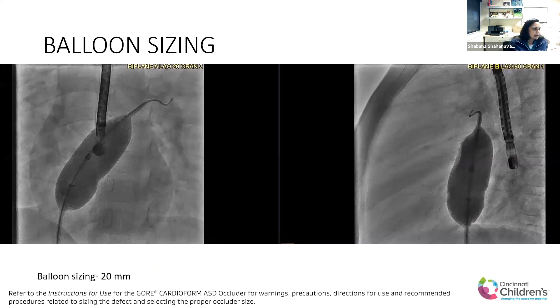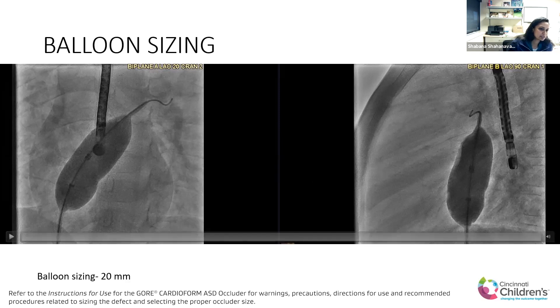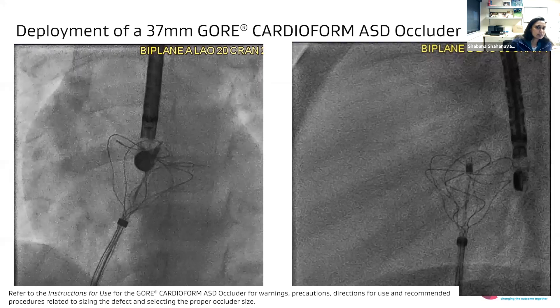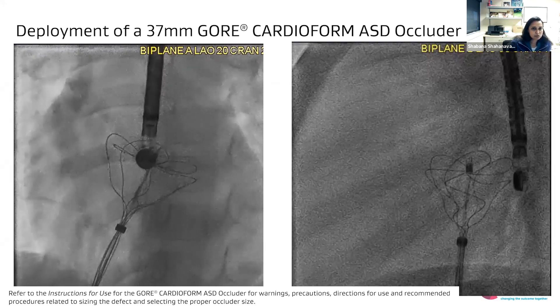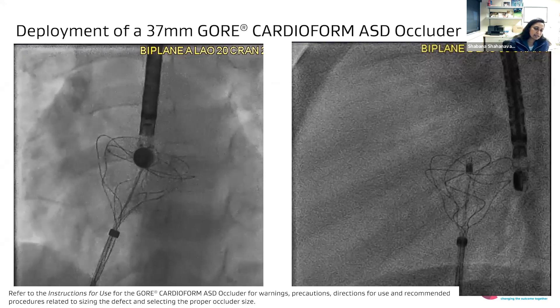This sized out in the cath lab to be around 20 millimeters. One thing for earlier practitioners is you have to choose if you're going to do stop flow versus oversizing your balloon, especially in a patient this size. So that measured around 20 millimeters, and they went with a 37 millimeter GCA.